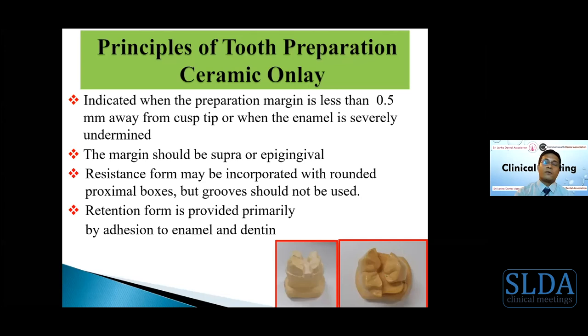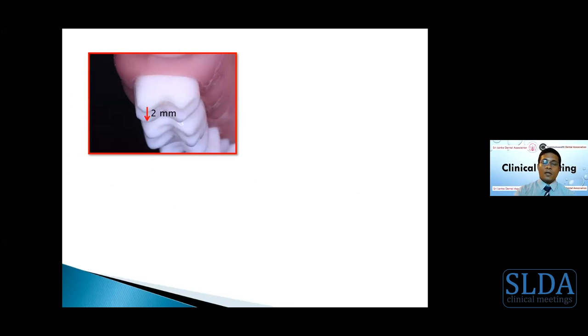And resistance and retention, mainly retention, is primarily provided by adhesion to enamel and dentin using adhesive cements. Again, this is how it should be done. As I mentioned, you can have your own designs according to the situation.